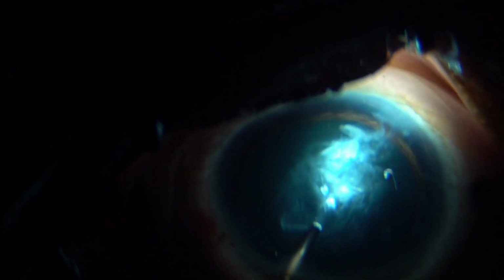Maybe the quality of my video can be better, but anyway, you can see the kicked up cortex. I'm going in with my phaco probe into the anterior chamber, just washing off those air bubbles. And initially I plan to do the stop and chop technique. This is only a grade 2 nucleus sclerosis, nothing great. So I am aspirating those cortical fibers.